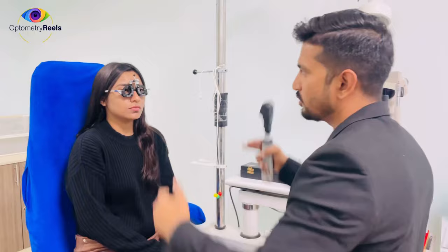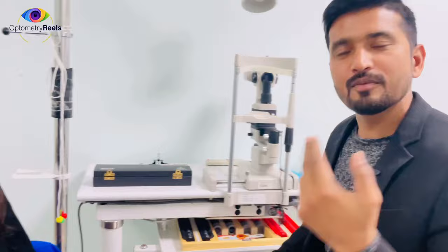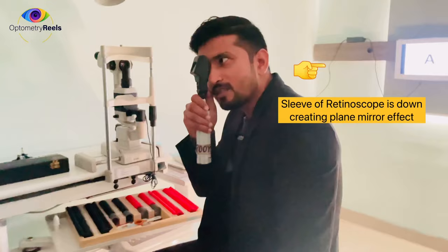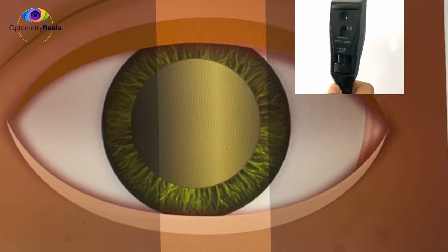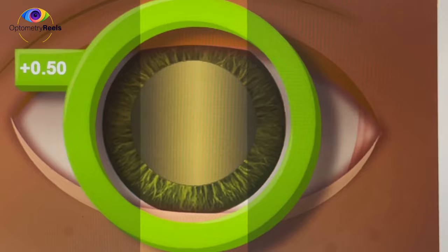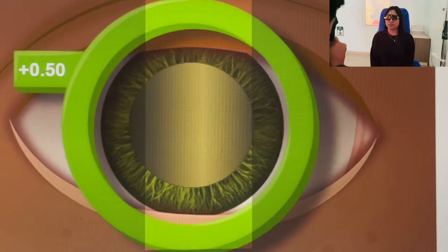Make sure your eye level is parallel to the patient's eye and you are not coming between the chart and the patient. With the room illumination dark, I'll check the nature of the glow — the movement and thickness as well as the brightness of the glow is equal in all meridians of gaze. Moving the retinoscope up and down, the glow inside the pupil is also moving in the same direction — this is 'with' movement.